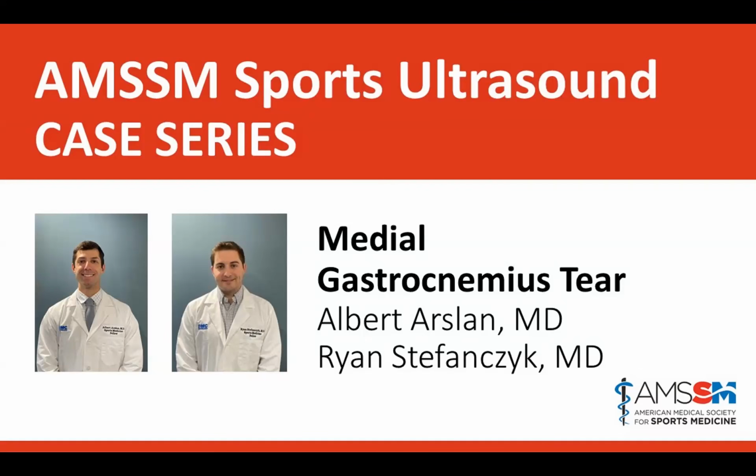Other than that, the other thing that you covered that I just want to re-emphasize is the differential in this area, including those soleus injuries, especially that distal soleus myotendinous injury, and plantaris injuries, which are frequently overlooked. They can be really helpful to understand from a rehab standpoint. Should we be working on the gastroc, the soleus, both? And for the plantaris injuries, especially in our athletes, we can really reassure them that they'll likely be able to return relatively quickly to sports because it's not a functional structure.